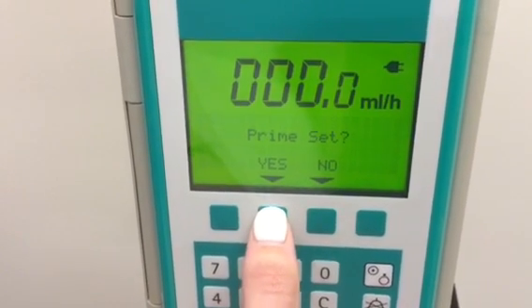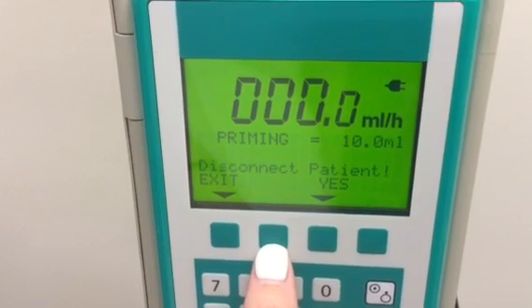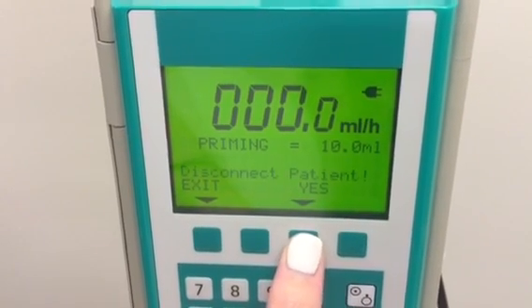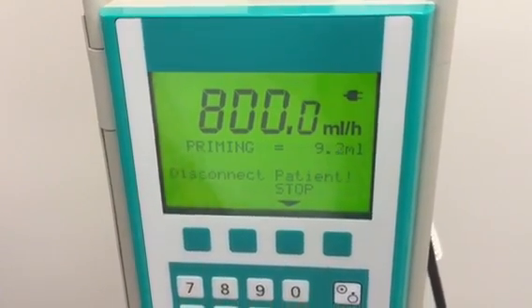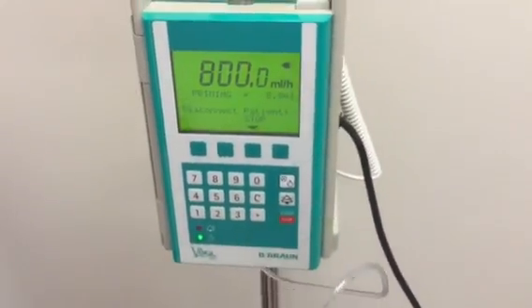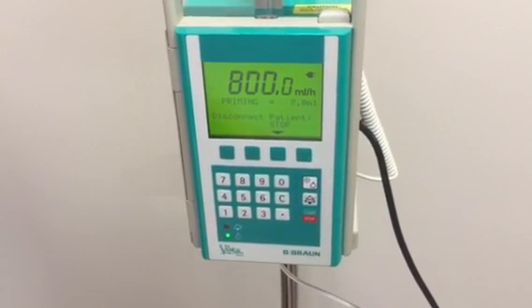We're gonna go ahead and prime our tubing. We're gonna say prime 10 ml's, yes. Make sure you are not connected to the patient. Make sure your roller clamp is unclamped, and we're gonna let it prime the full 10 ml's.